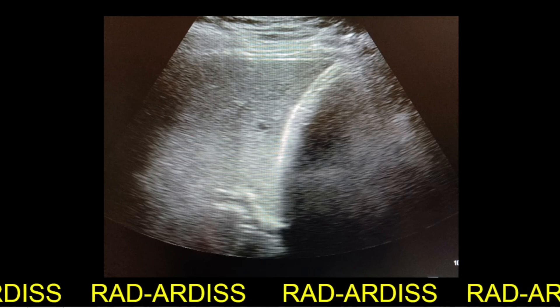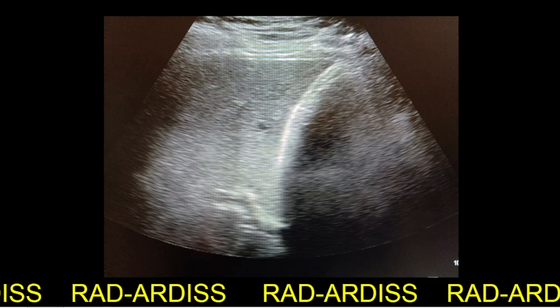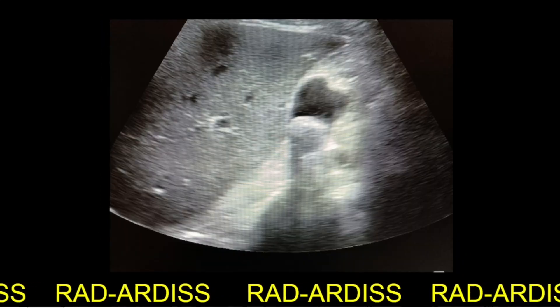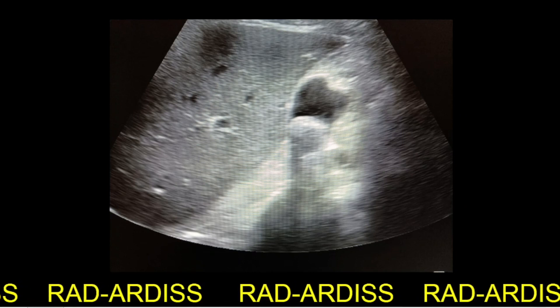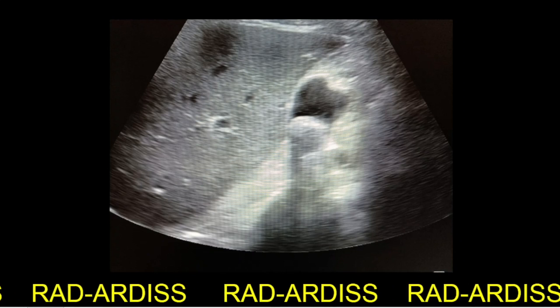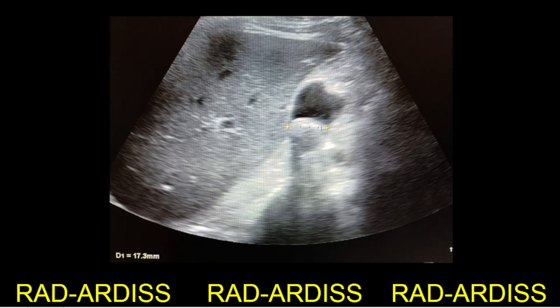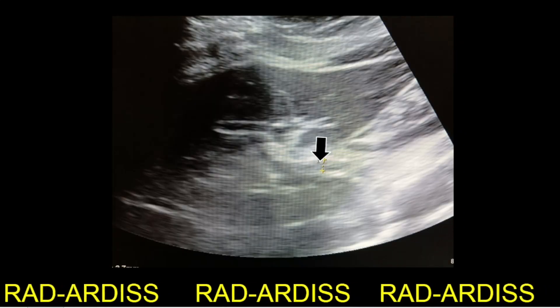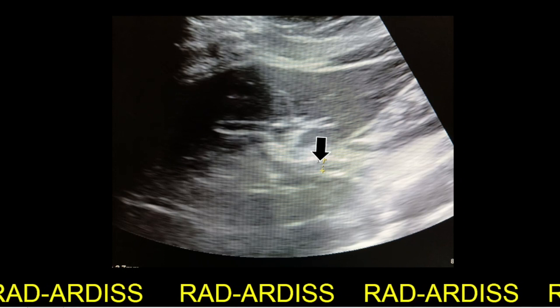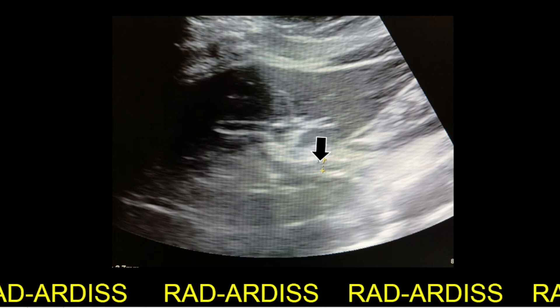This is another case — a case of cholelithiasis. The calculus can be seen inside the gallbladder. The diameter of the calculus is 17.3 mm. We also see the common bile duct; this is its normal appearance, measuring 3.3 mm in diameter.